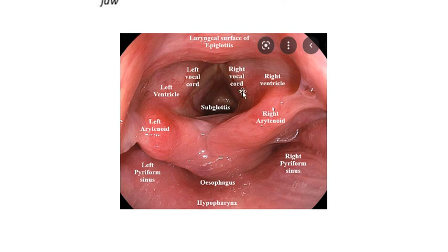These shelf-like projections on the upper plane are the vestibular folds. These shelves in the lower plane, with the white colored margin, are the vocal cords. Below the vocal cord, obviously, is the subglottis, and we can see some tracheal rings also. The posterior part is the hypopharynx or laryngopharynx, and here the pyriform fossa is there lower down. The continuation will be the esophagus. So this is most important.